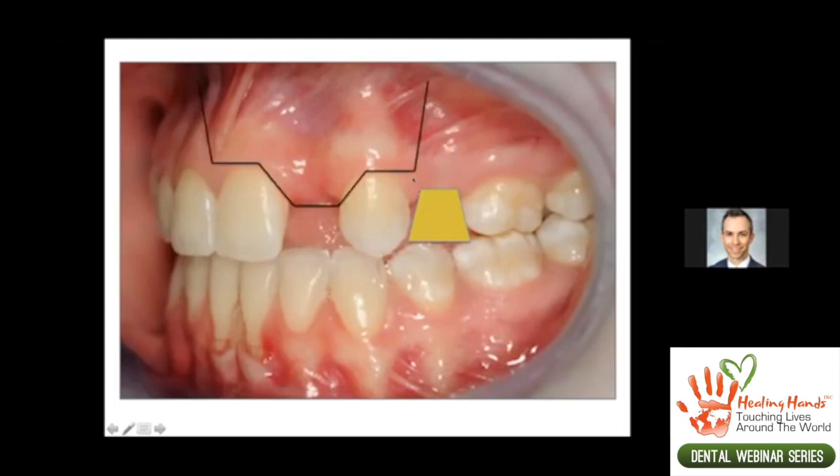Currently, my preferred way to make the incision is from the crest and coming around. I like a broad-based exposure so I can get my membrane completely around the bone graft and tack it down and get tension-free closure. I want the incision to be further away from the graft where I don't have to worry about a dehiscence.